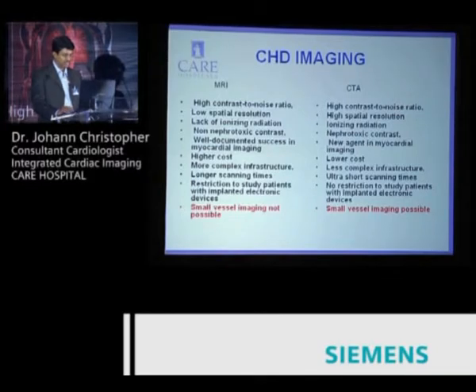And so for the smallest infants, we really try to avoid MRI because of the coil problem, the resolution problem, and also because the MR studies take at least 30 to 40 minutes. These are very complex congenital hearts, and they require a lot of segmentation, so we prefer CT in this group.